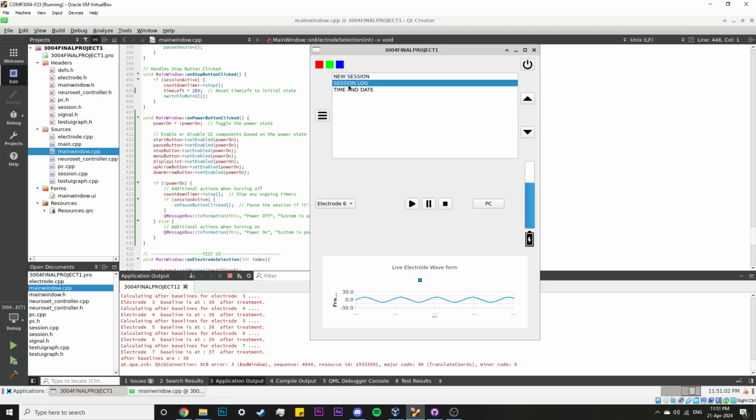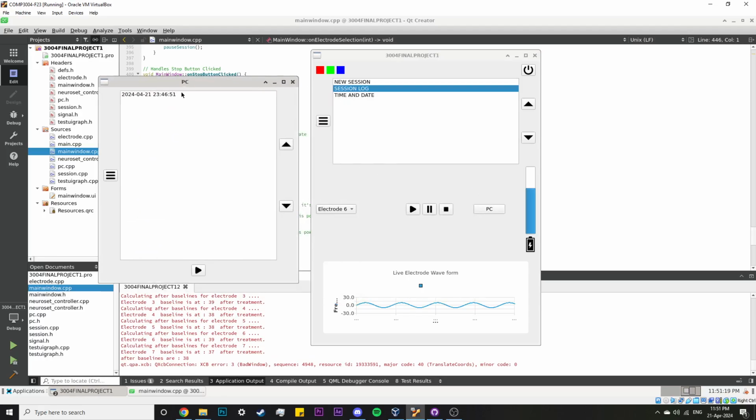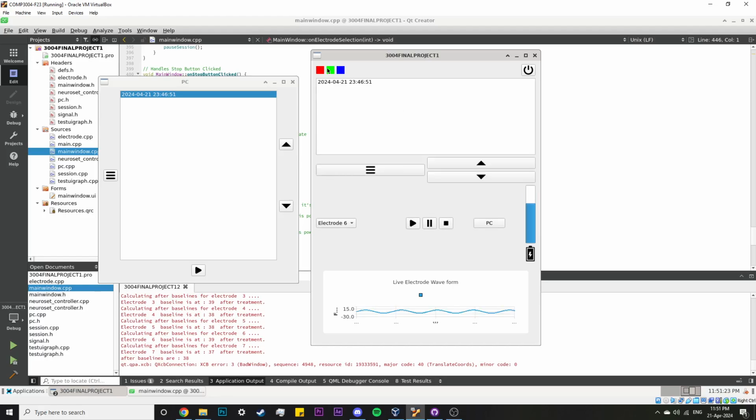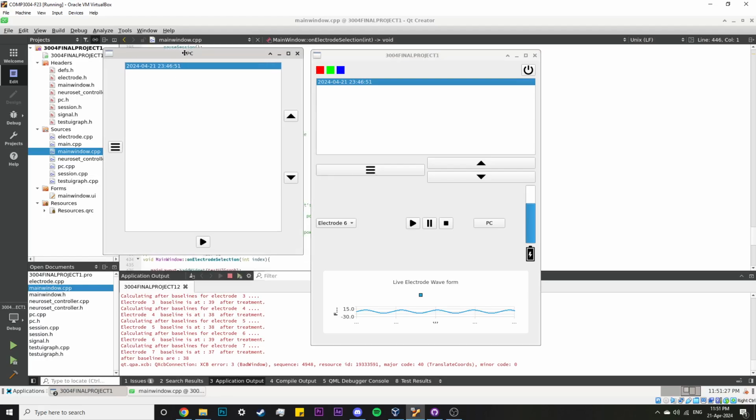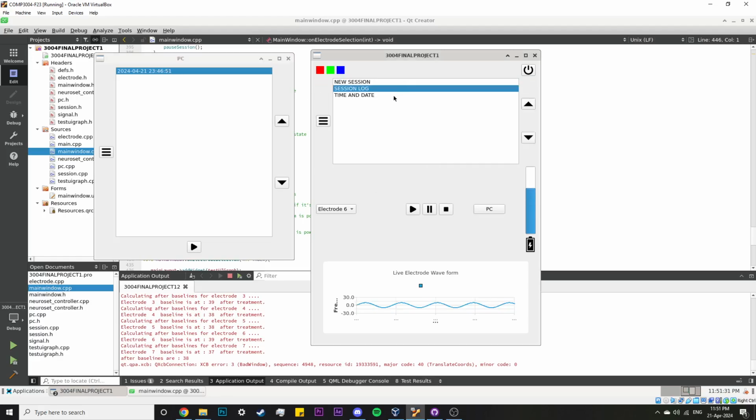Also, it should be noted that in our demo of the application's various features, as referenced by the use cases, we have consequently shown the different requirements from the requirements traceability matrix. Great, and we'll cover one last thing with the PC UI. It also shows that each session log created is displayed on the PC, which can be used for further analysis and display of each session log.